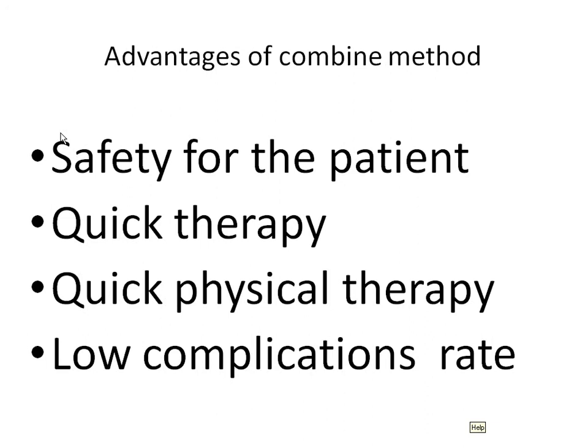So the advantages are safety for the patient, quick therapy, quick physical therapy, and a low complication rate. Here you can see some patients which we treated. This is the application of the rod, external fixation, and osteotomy. Here we can make distraction, and when we reach the desired distraction, in this case 4.5 centimeters, we lock it distally and take the fixator away.